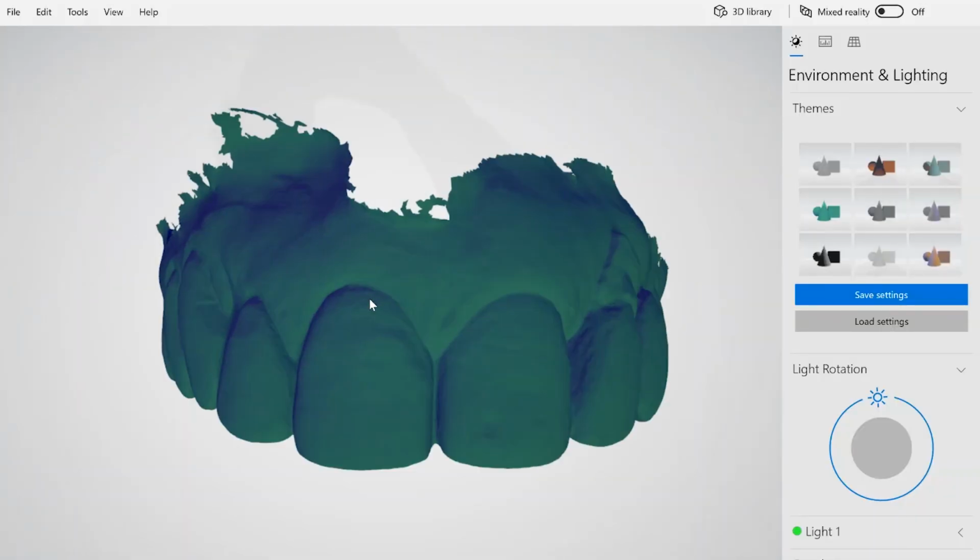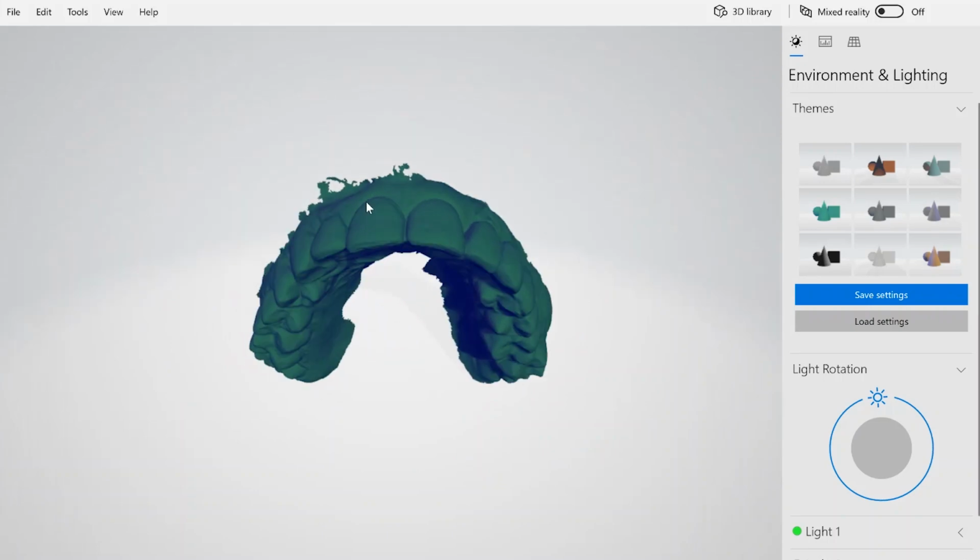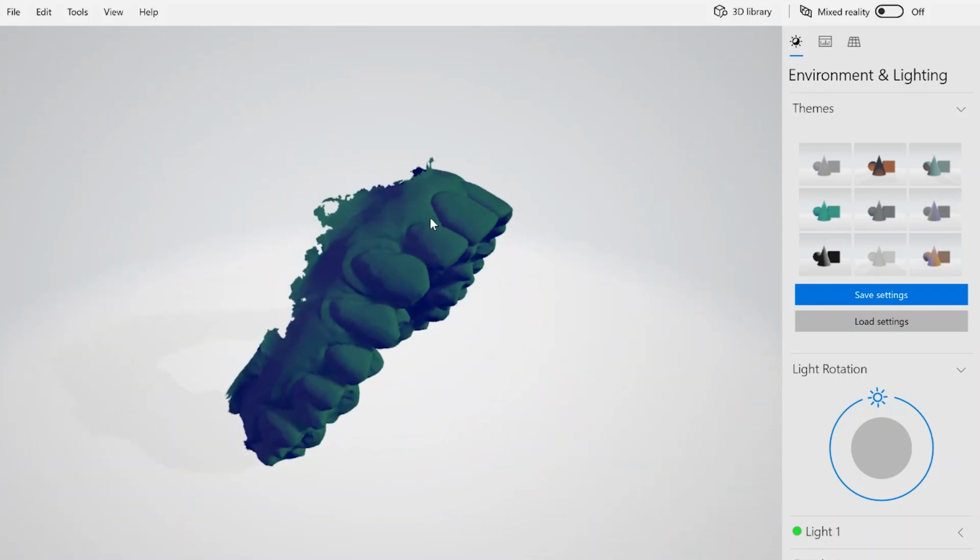But the CT scan isn't good enough to make a guide on its own. You see, what we now need is a 3D model of your teeth. And I get this in a number of ways. First of all, just with a standard dental impression, a dental mold, we can send this to the lab and get this scanned in to make what we call an STL file, which is a 3D model file of your teeth.